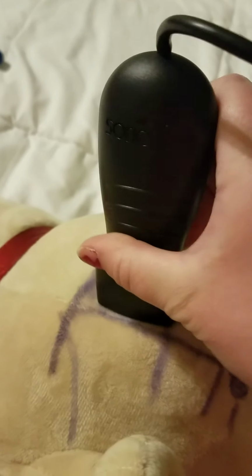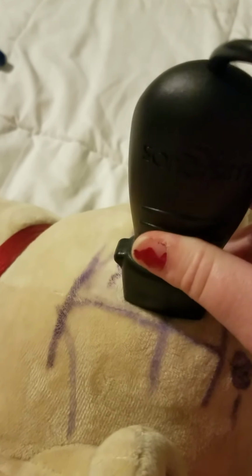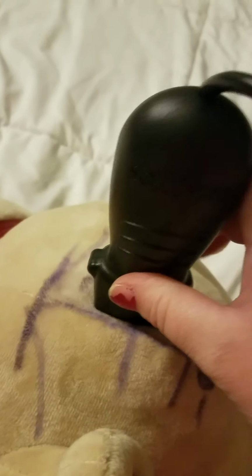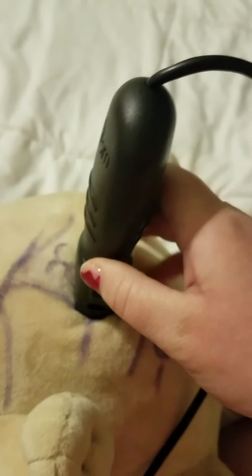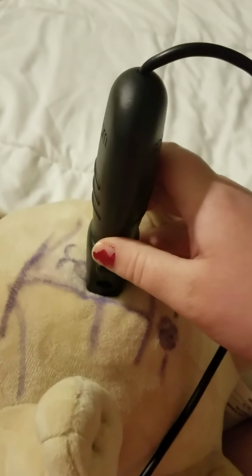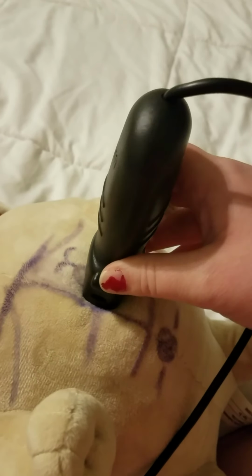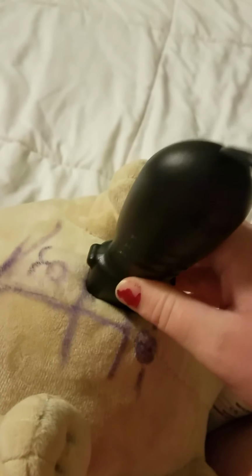Then you're going to turn back into long. You're going to slide distal, and then you're going to be at your mid. So here is your mid aorta. You're going to see the SMA branching off of there as well. You're going to take an image in long, and then you're going to switch it over to short. You're going to take an image in short, and then you're going to measure it A to P, and then you're going to come back to long, slide on down. Then you're going to find your distal.